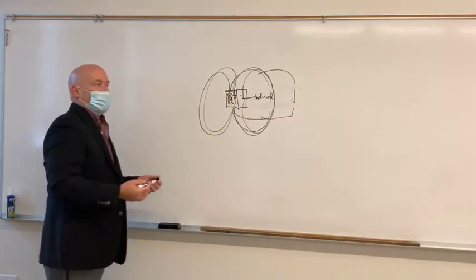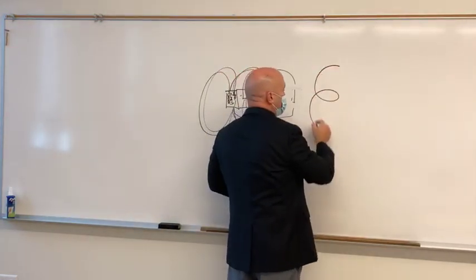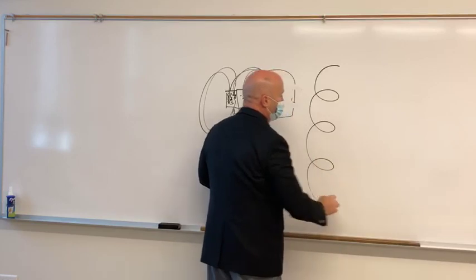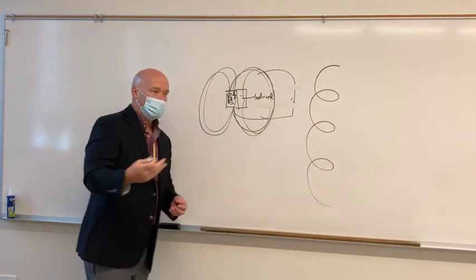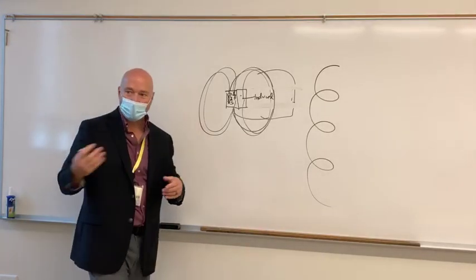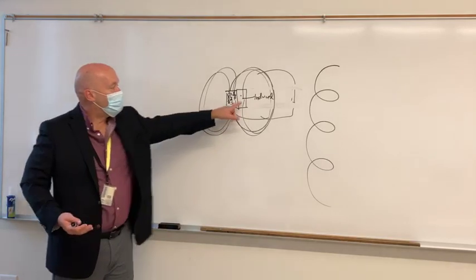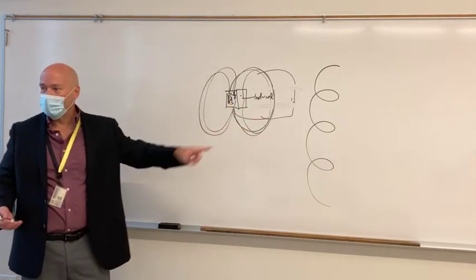All right? So where we run into a little bit of a problem is copper. I don't know where it falls on the spectrum of diamagnetic versus ferromagnetic versus paramagnetic. It doesn't really matter. It's just not as magnetic as iron, okay?